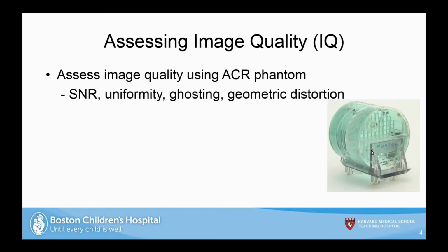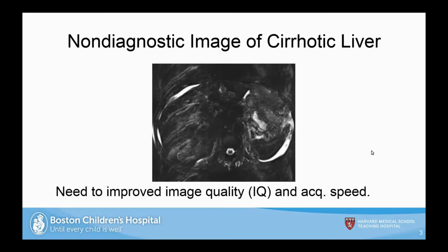Just to review the motivation here. Wouldn't the MR technologists just be able to easily see this and then just repeat the image? Yeah, so they want to be able to do that in real time while the patient is on the table. But I'll explain that later. It's just because it takes a while to get the image, and then when they get it, they realize, oh, it's not diagnostic, you can't use it. I see. So you want to be able to make the determination before the image is even reconstructed, as the patient is on the table? That's what I understood from their paper.